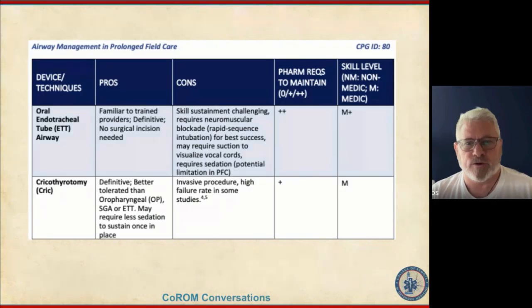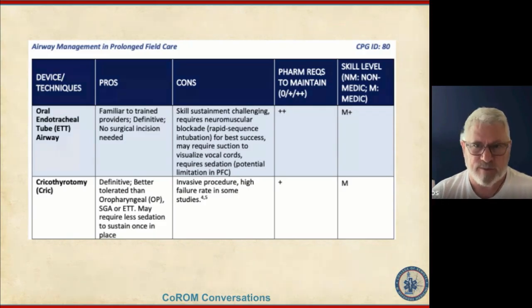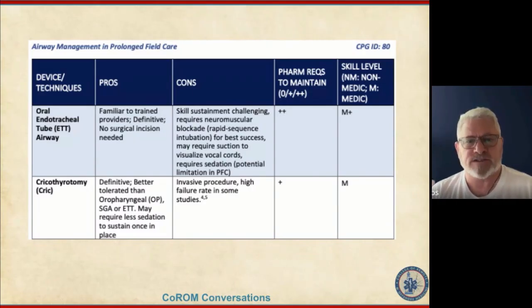The cost of doing a BVM and positioning is that you tie up a person to do this. You may end up tying up two people if one person is not able to secure the seal, maintain an open airway, and bag at the same time. You might need two people, where one person holds the mask in proper position and maintains a good seal, and somebody else squeezes the bag at the appropriate rate and volume. There's a cost for everything.